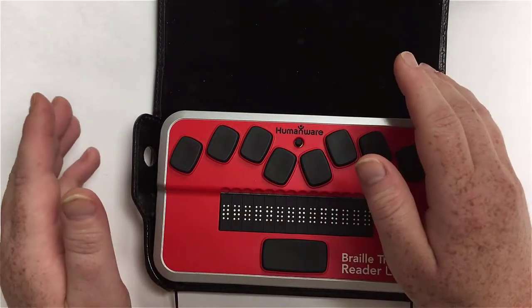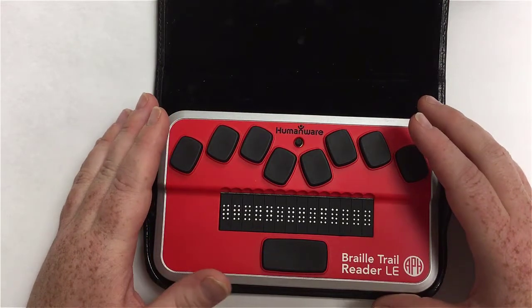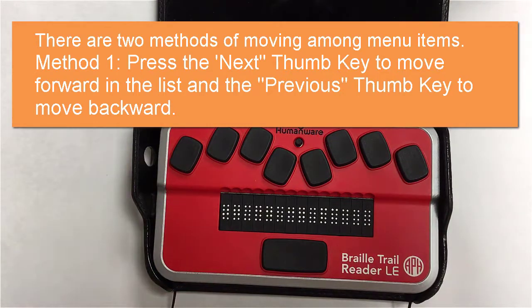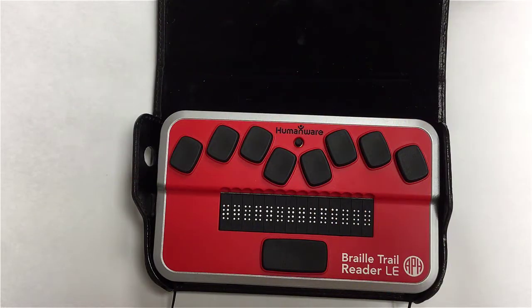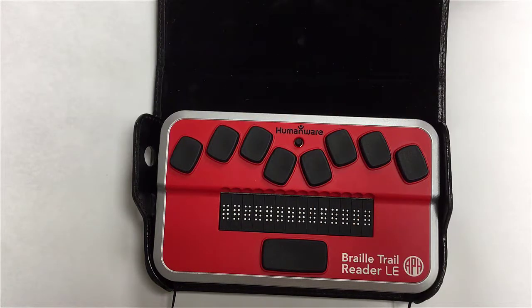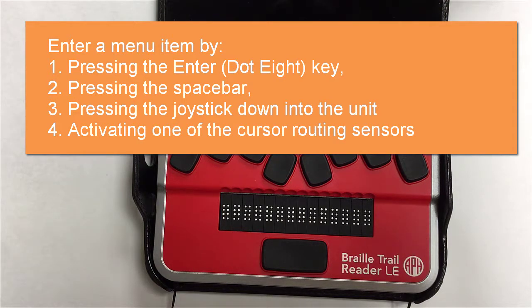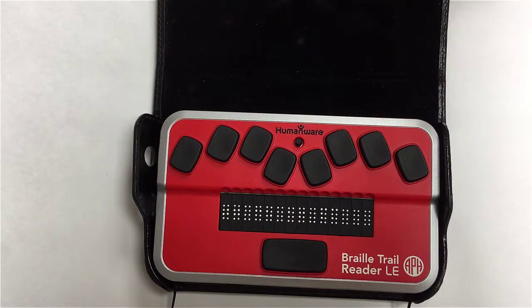To navigate the menus, you can use either your outer left and right thumb keys to go to the previous or next item, or you can use the left and right joystick. To enter a menu, you can do the joystick down, use the enter key which is dot eight or space, or touch the cursor routing sensor above the name of what you want to open.